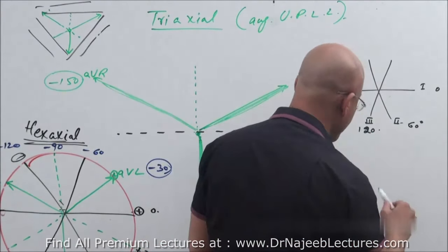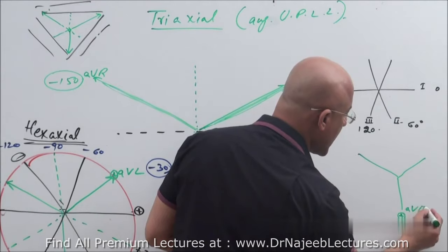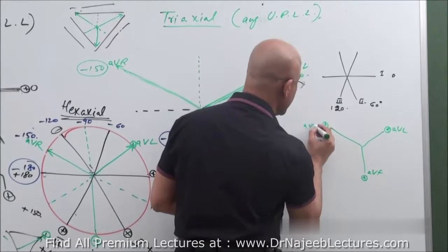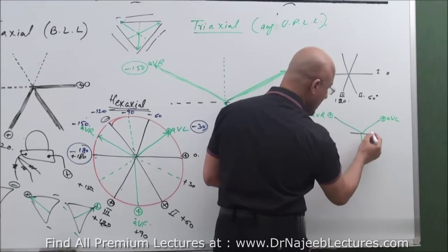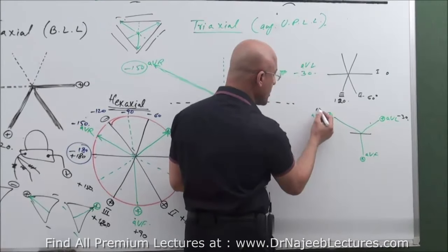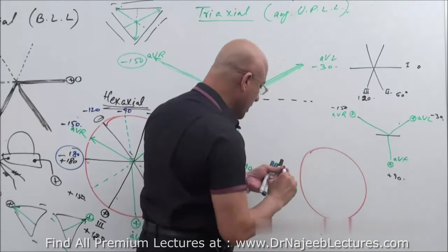Now, which lead is this? AVF. Here it is AVL, and here it is AVR. And what are the orientations? This is at minus 30, this is minus 150, and this is plus 90. And now rapidly we make this, and you will tell me which I'm drawing.